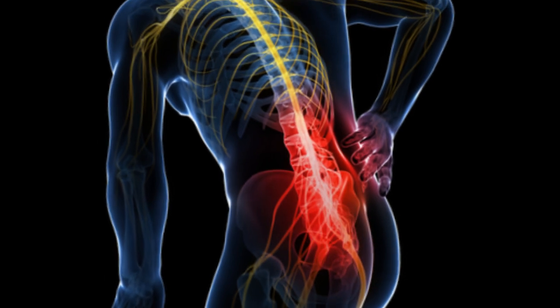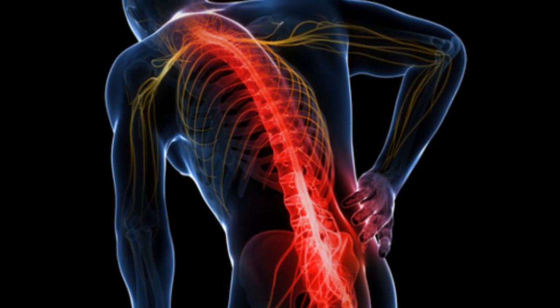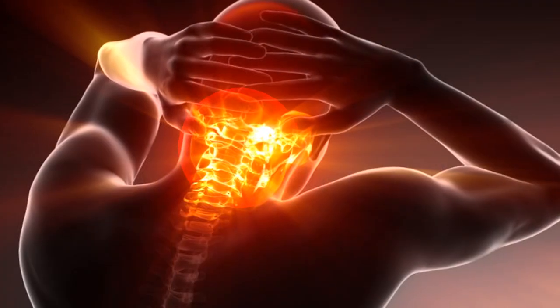Spinal cord stimulation, also called neuromodulation, uses electrical impulses around the spinal cord to prevent pain impulses from reaching the brain.